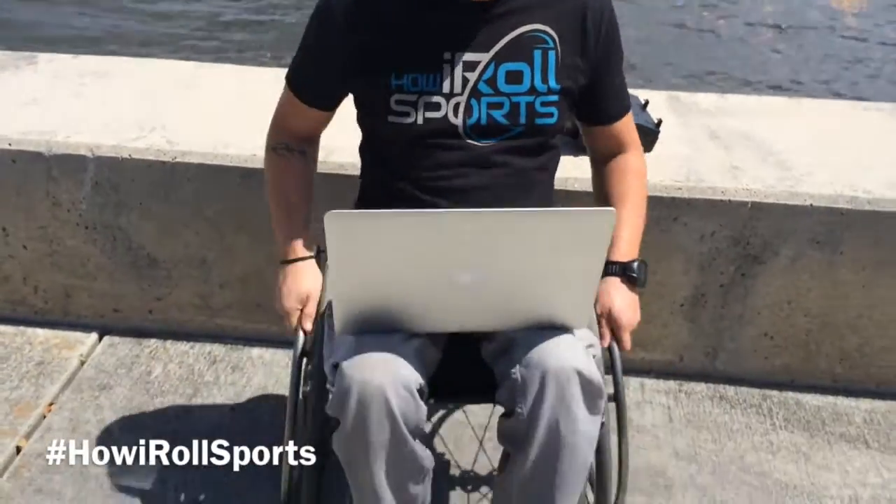I'm Jake with How I Roll Sports. If you're like me, this is a pretty standard situation: laptop on your lap, potential to fall. You found a mount for your laptop — any laptop.